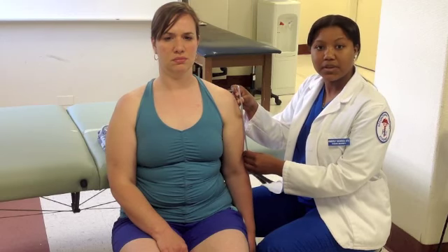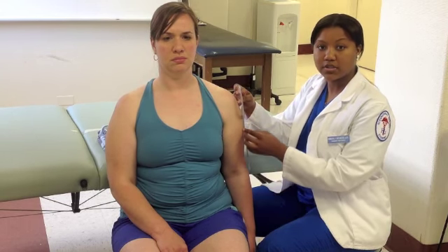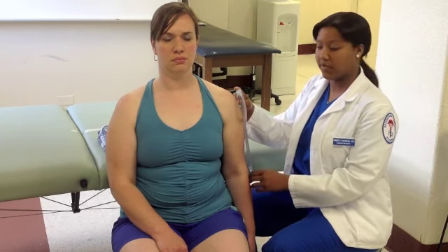The weight of the trunk is the stabilizer, and the scapula should be left free to move. The therapist should place the axis of the goniometer at the lateral aspect of the center of the humeral head, about 2.5 centimeters inferior to the lateral aspect of the acromion process, with the stationary arm parallel to the lateral midline of the trunk and the movable arm parallel to the longitudinal axis of the humerus. The client should move the humerus in an anterior and upward direction to the limit of motion.